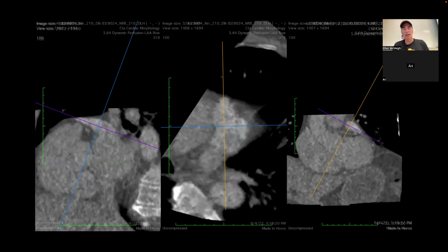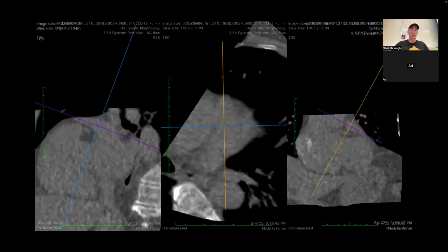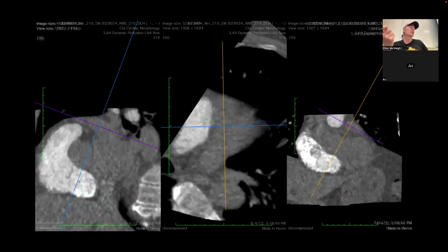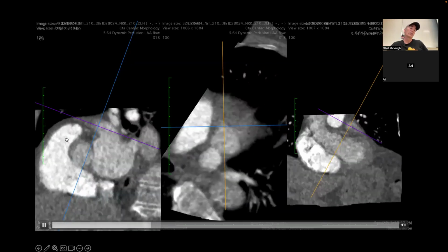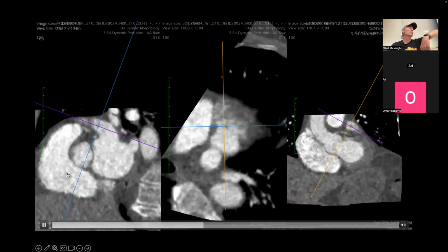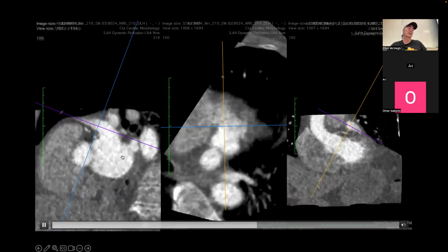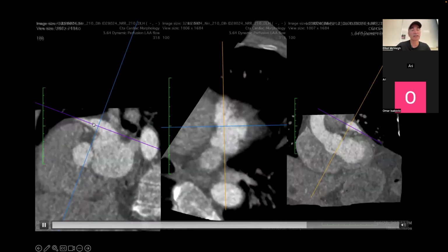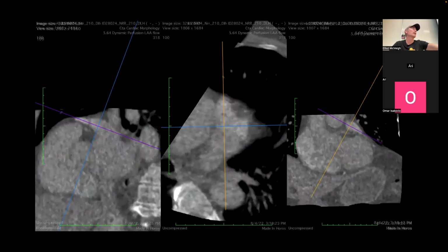So this is interesting, remember we're going back maybe two lectures now, where we're going to take a CT image with low dose. This is why the images look so grainy, but we're going to take a set of images as we inject the contrast agent to see how it moves from one chamber to the next in the heart. When you inject it into the patient's vein, obviously the right side of their heart lights up first because it comes into the right atrium and then the right ventricle. After that, it goes off to the lungs and comes back to the left atrium, which is this thing here. And I've cut this such that we can see at least one slice through the left atrial appendage for all of these views. There's 27 time frames here, and we're playing it back as a movie.